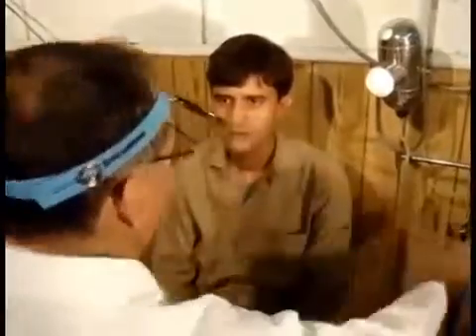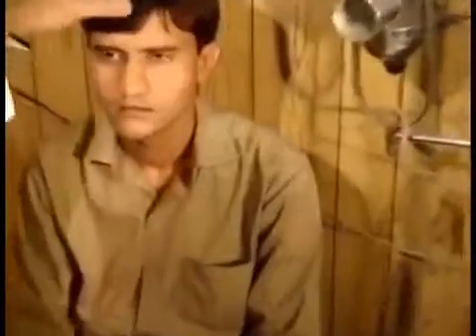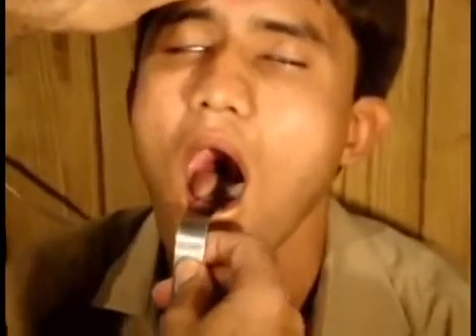We'll focus the light on the patient's face and mouth. Now we'll take the tongue depressor. We'll instruct the patient to open the mouth so that we can see the throat. Then with the help of the tongue depressor, we'll depress the anterior 2/3 of the tongue.